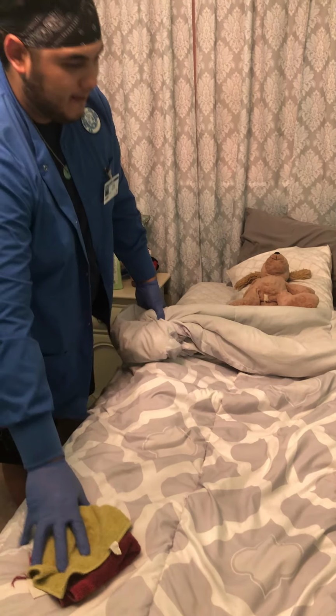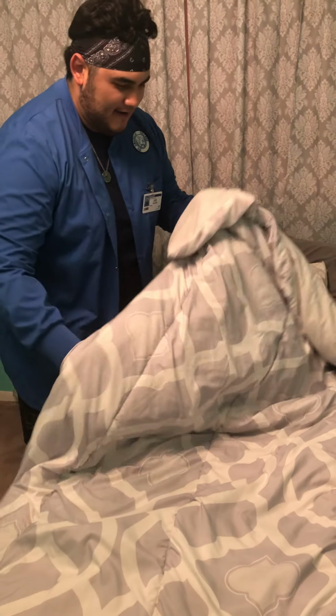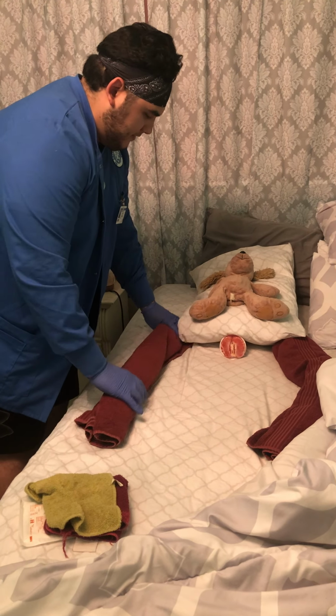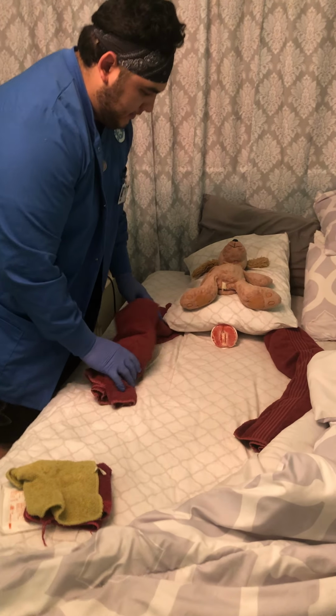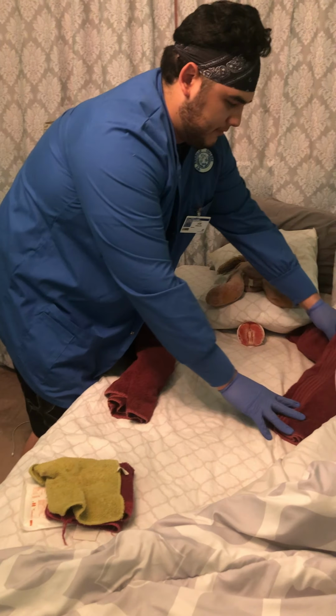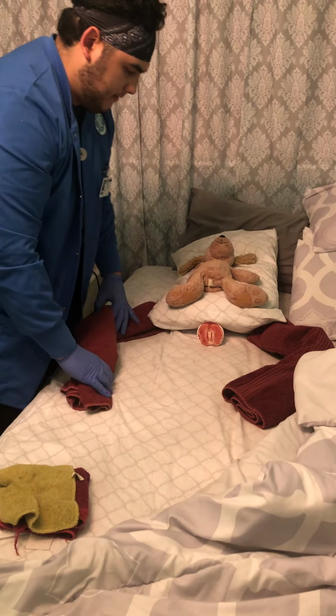Miss Moore, sorry for the visual here. And then we've got the patient's legs bent a little bit. Typically they would kind of go out like that.